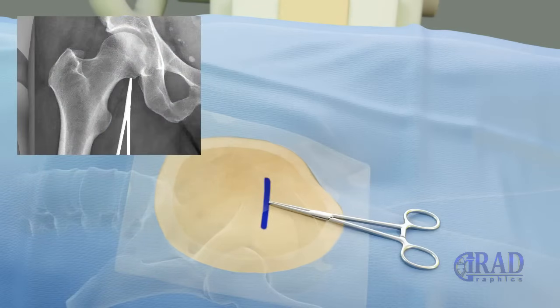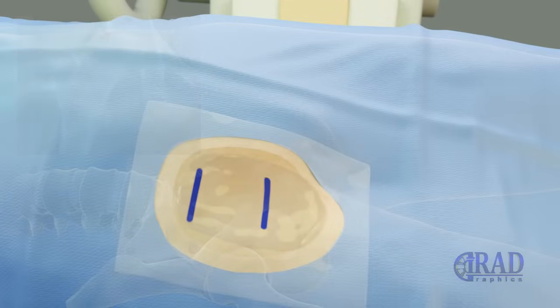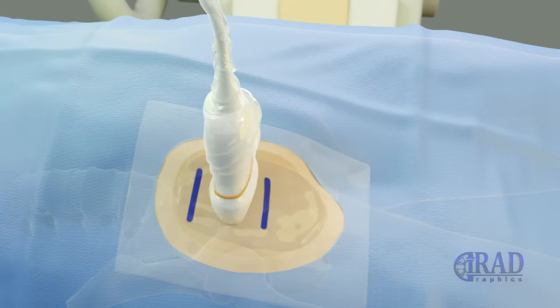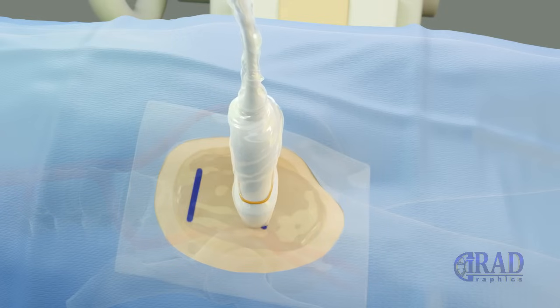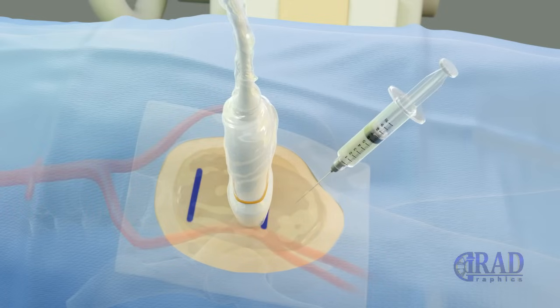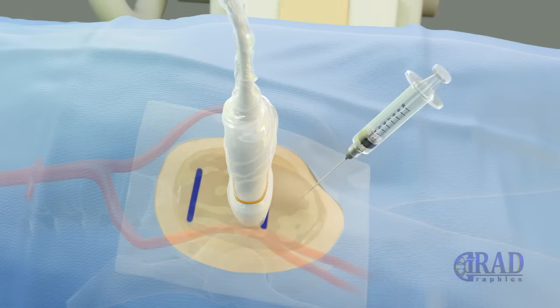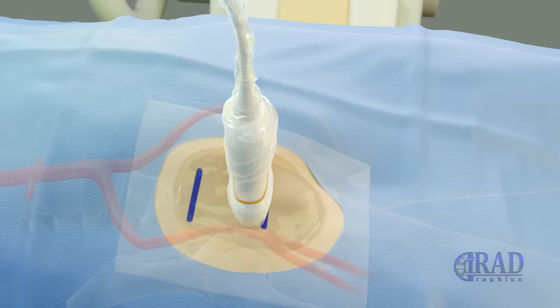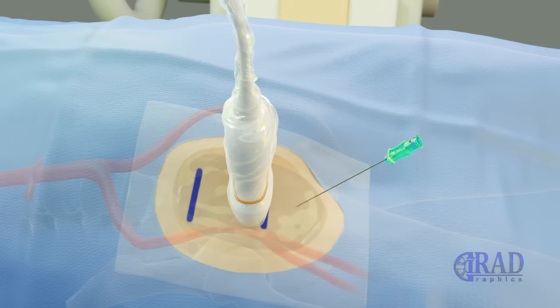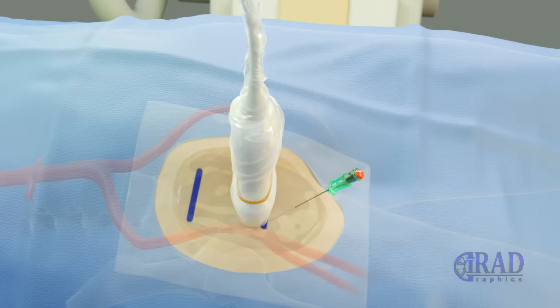As the first step, the skin in the contralateral groin area is marked based on the upper and lower margins of the femoral head. Once the desired location of the common femoral artery for access is identified under ultrasound, the skin entry site is numbed by injecting lidocaine. Then, the contralateral common femoral artery is accessed under ultrasound guidance using a micropuncture needle directed toward the pelvis.